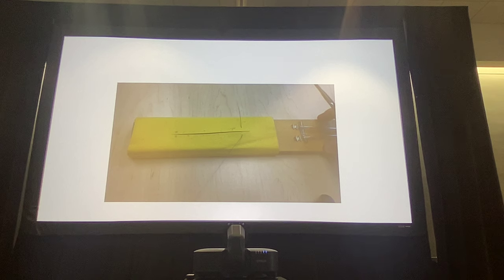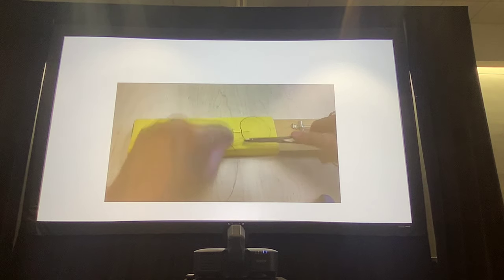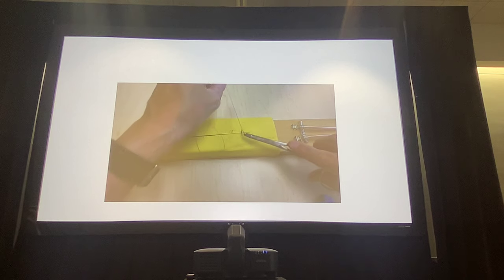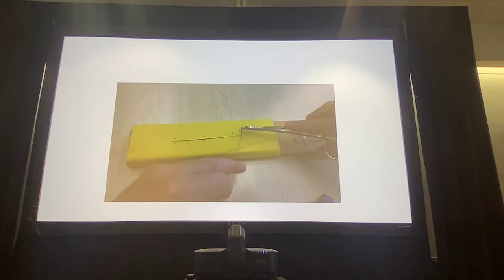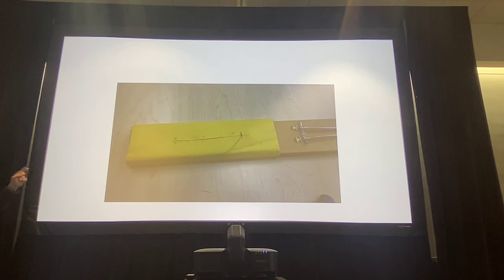And I would say graduate to this from simple interrupted, starting by the safest layer, which is probably skin, and then you could always venture into abdominal organs, if you're going that far with this, once you feel confident in it. So you start off with a surgeon's throw, then square knot. So he only cuts one side, then he's going to now run his suture. So we're not cutting the other side.